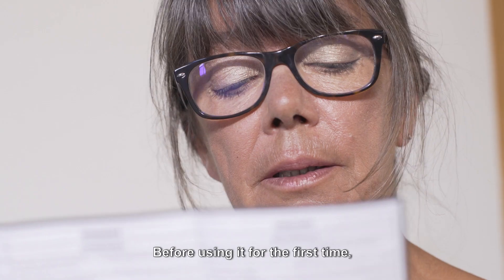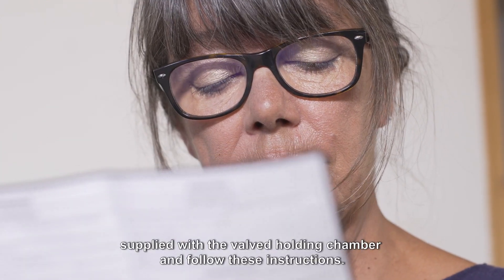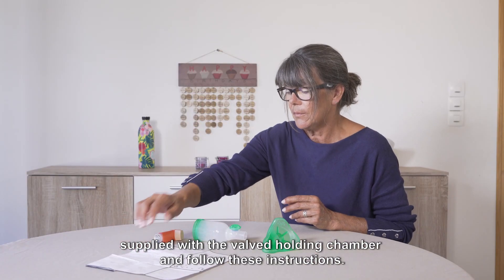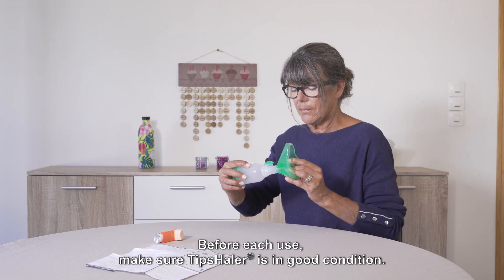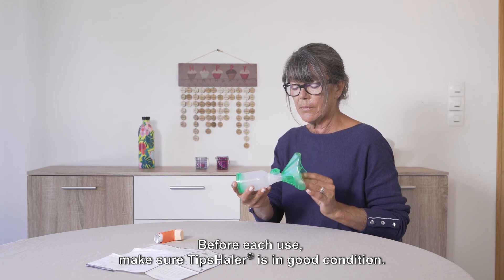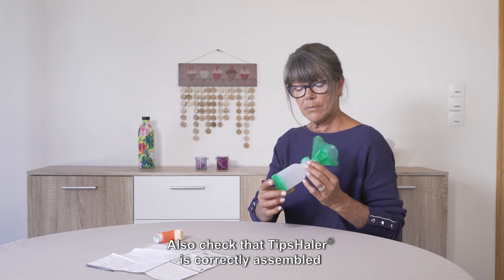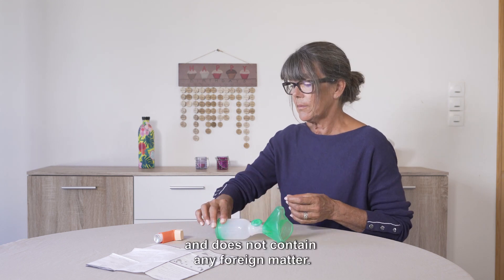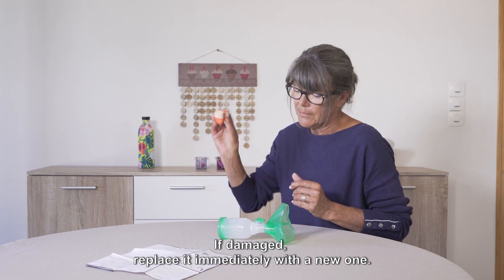Before using it for the first time, please read the instructions of use supplied with the valved holding chamber and follow these instructions. Put the mask on the mouthpiece. Before its use, make sure TipsHaler is in good condition. Also check that TipsHaler is correctly assembled and does not contain any foreign matter. If damaged, replace it immediately with a new one.